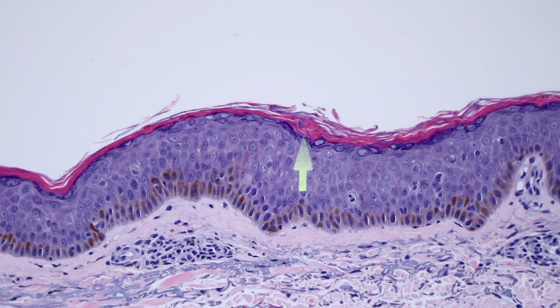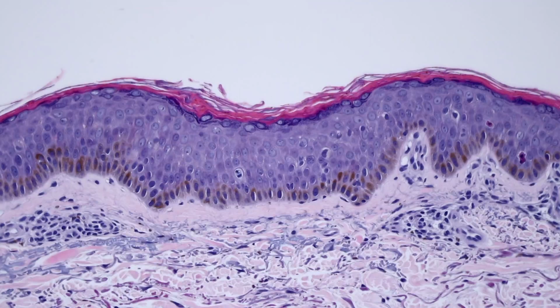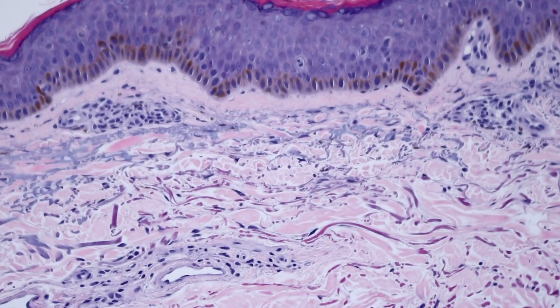I'll tell you what this reminds me of. This reminds me a lot of HSIL, a high-grade squamous intraepithelial lesion, which is basically the modern name that we currently use for HPV-driven squamous cell carcinoma in situ or high-grade dysplasia in the anogenital region. But I see similar things that look like HSIL and look HPV-derived occurring on, look, this is like on an old person's forearm or something.